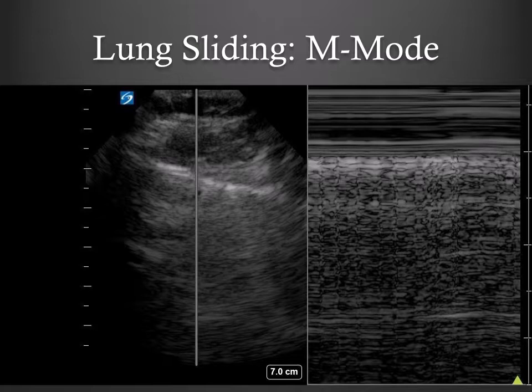You can also visualize lung sliding by pressing the M-mode button and freezing after a full respiratory cycle. In normal lung, the screen will demonstrate a long, uniformly pixelated strip that moves with respiratory variation, creating the so-called seashore appearance.